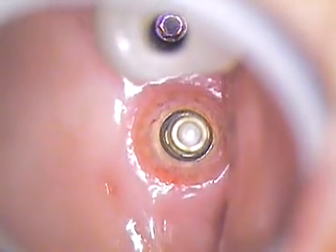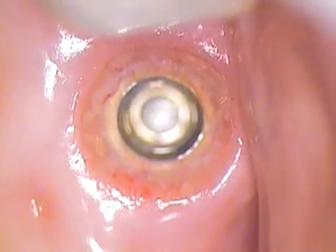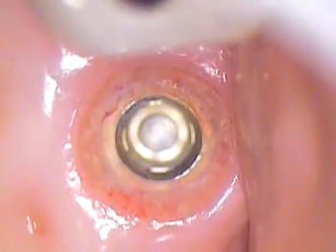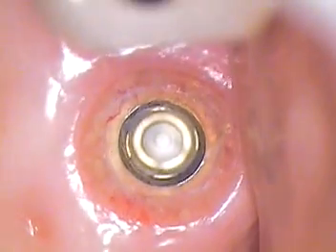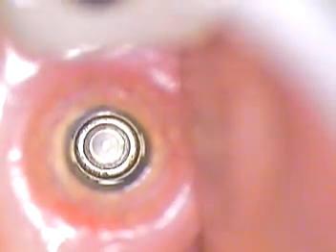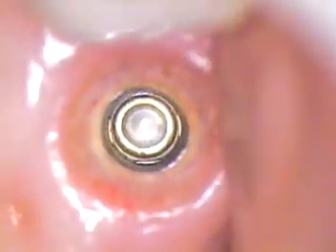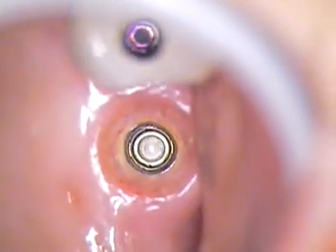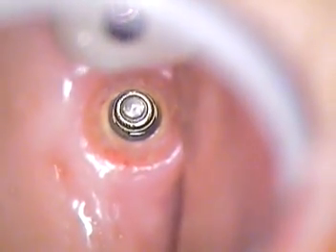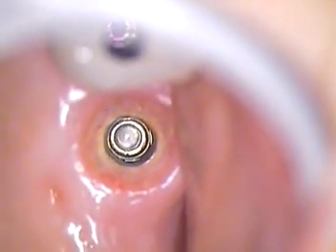So we're looking straight down. Let's take a closer look at how healthy that socket is. Now we can thank our surgeon, Dr. John Lindsay, for this case. He did a great job. He's in Boca Raton. You can look him up as well. Soon to be linked to my website. He's doing an excellent job. And if you look all the way down inside the implant body, you're noticing that there's no fluids down in there. There's no blood in there. There's nothing disturbing the threads. It's clean. And that's what you want to see.